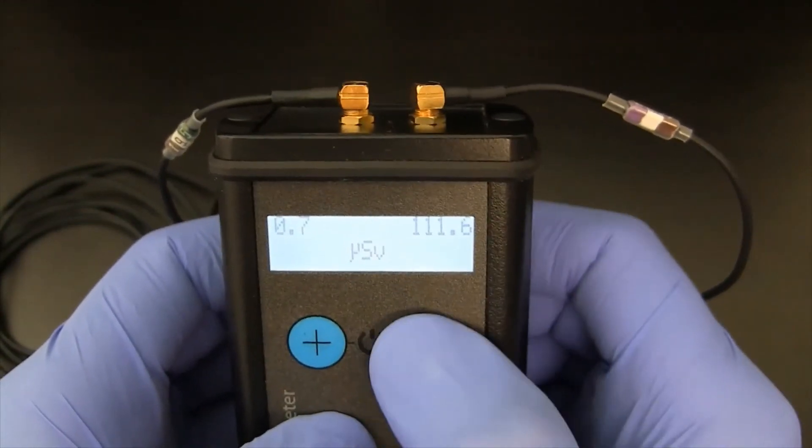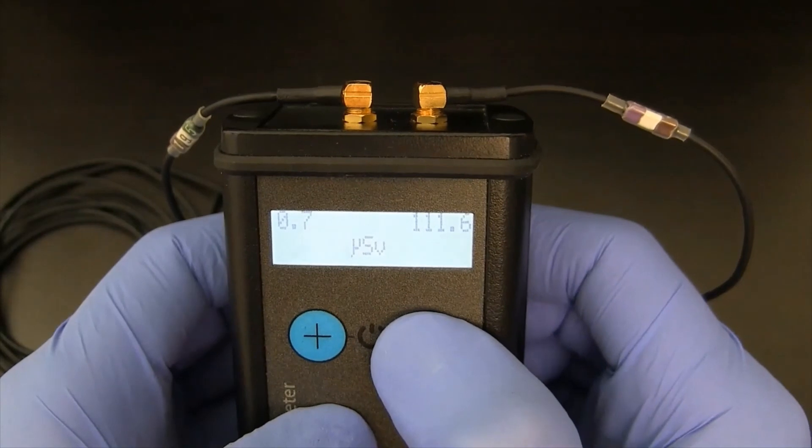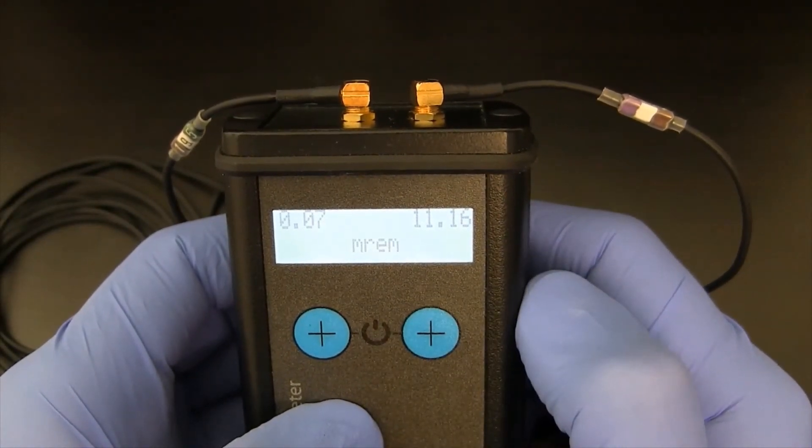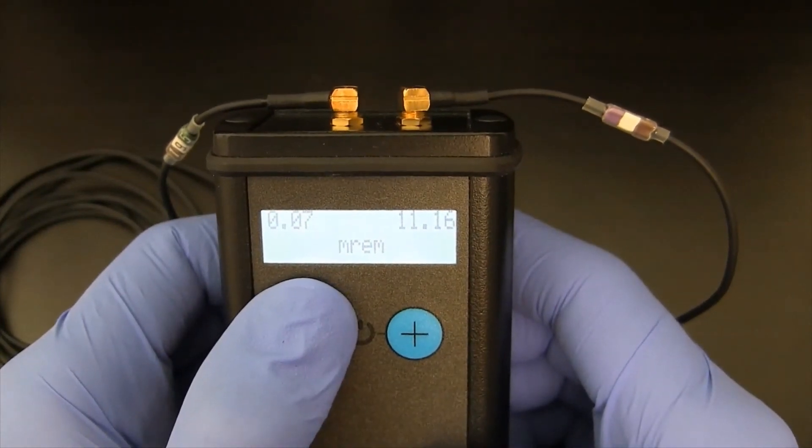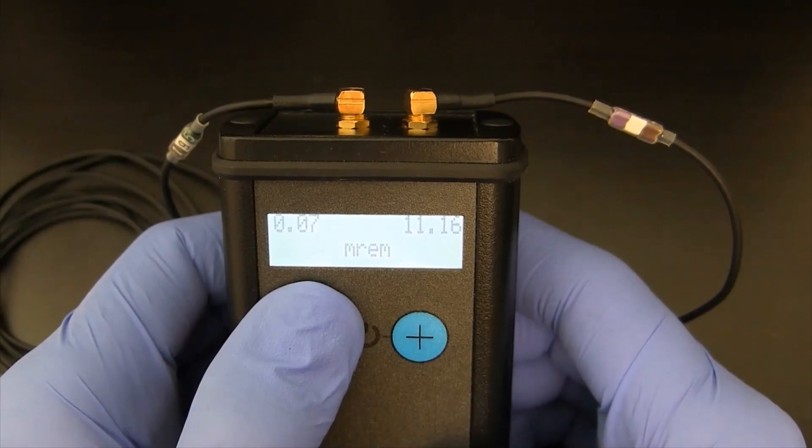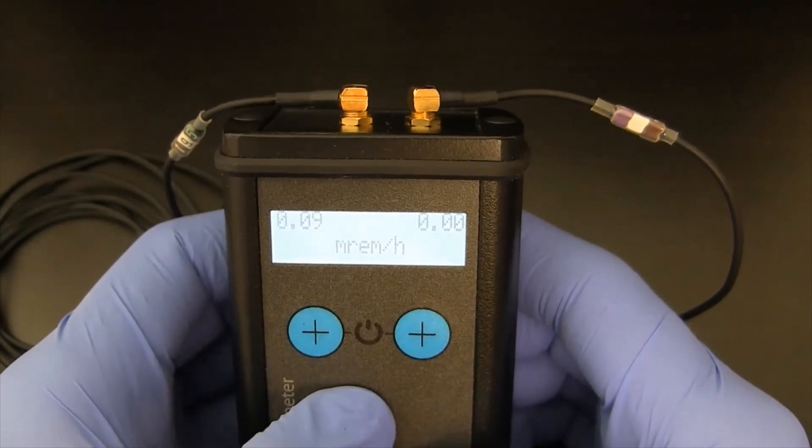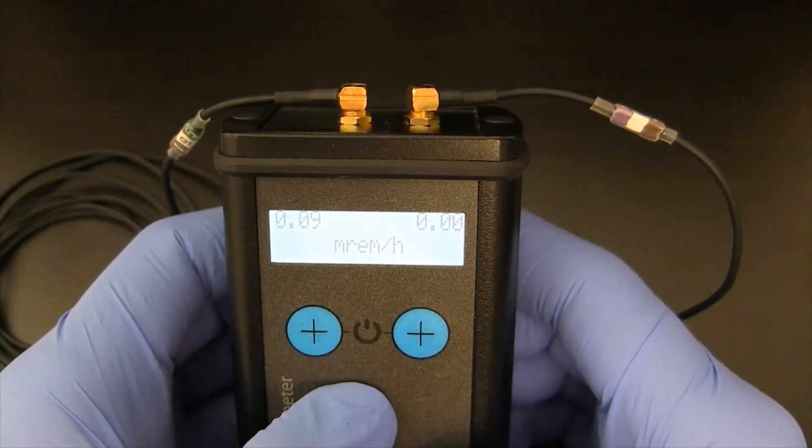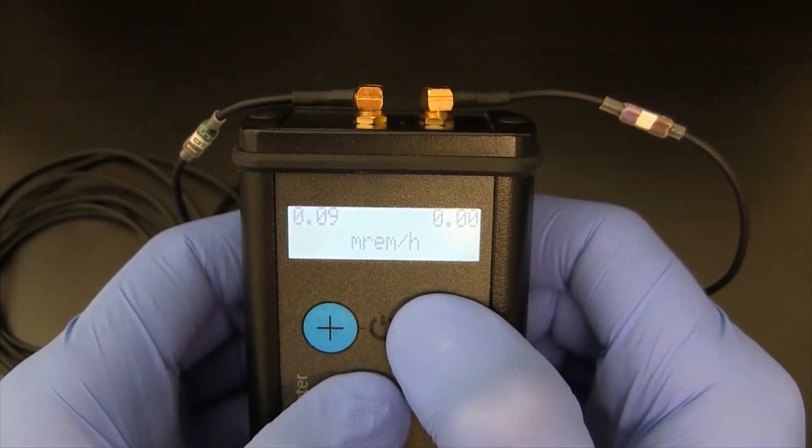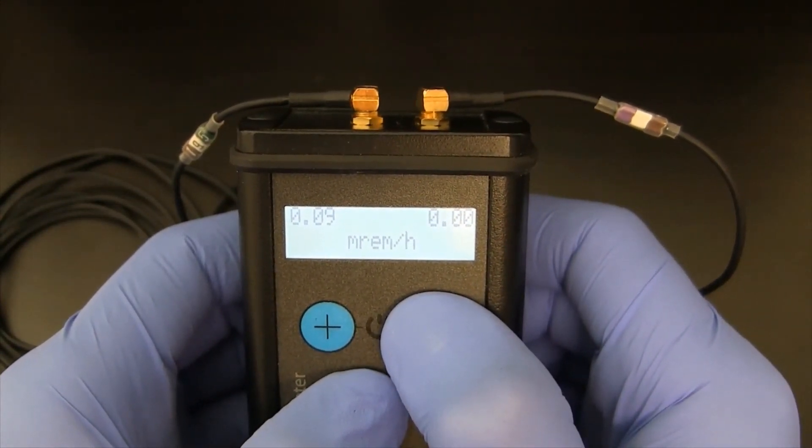If I go and hold the right button down, it'll change from SI units to US units. And the same then with the left button. If I hold down the left button, it'll go from millirem dose to millirem per hour or dose rate. By holding down the right button one more time, I can go back to SI units.